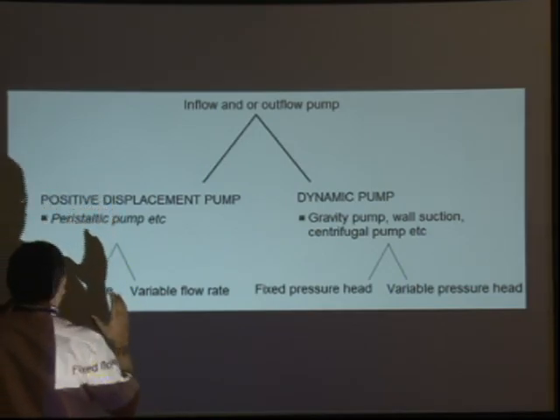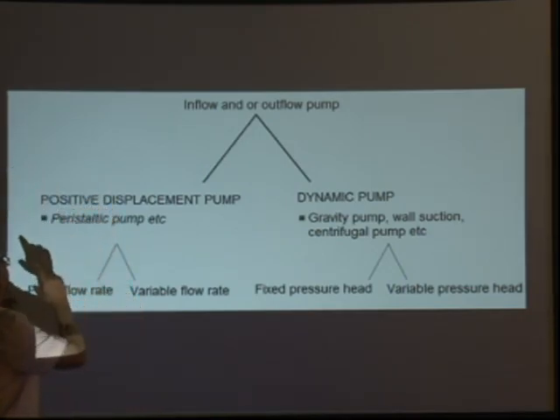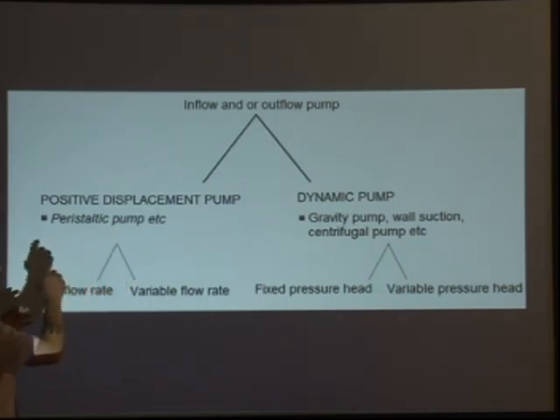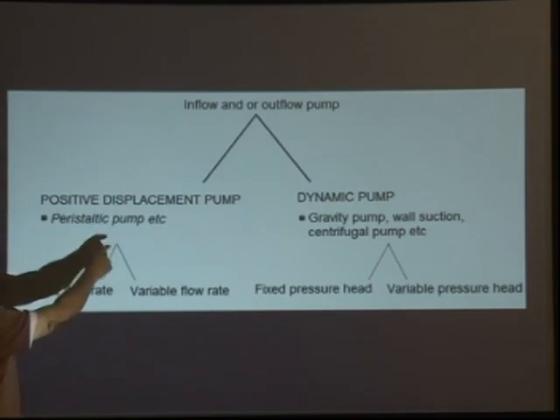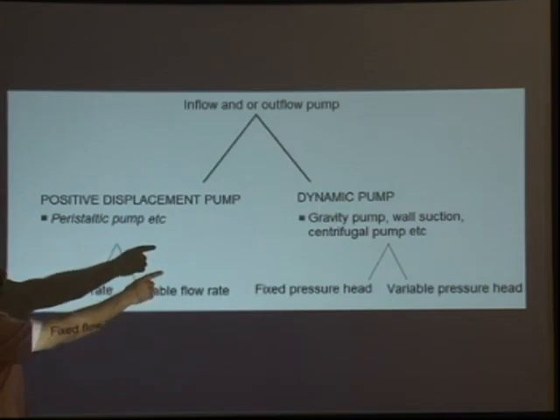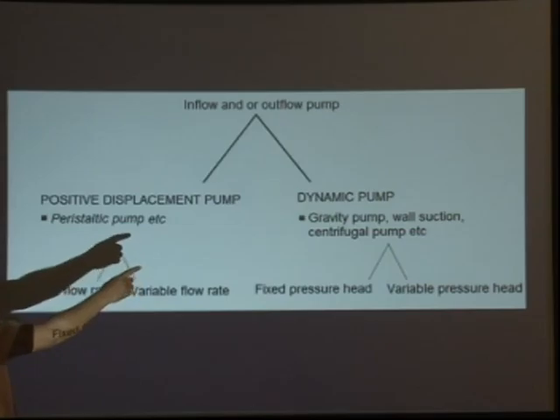The pumps are only of two types: the positive displacement pump, like the cycle pump by which you fill the tire, and the dynamic pump, which you have in wells. So there is the peristaltic pump on the inflow side, and the dynamic pump, that is a centrifugal pump or a gravity pump, on the outflow side. And complex hysteroscopic work.